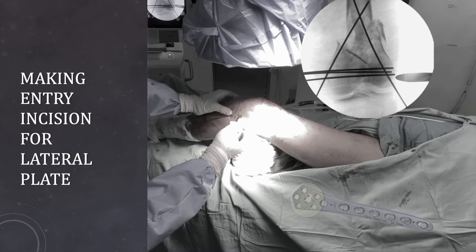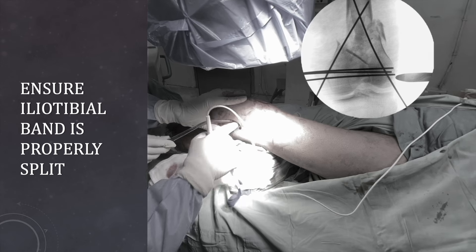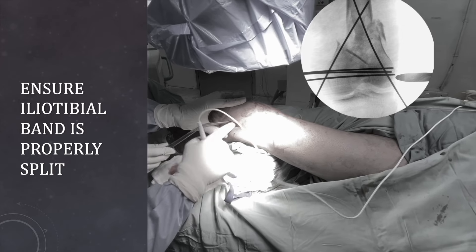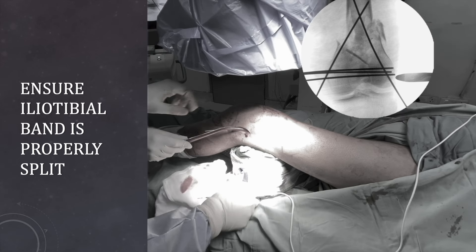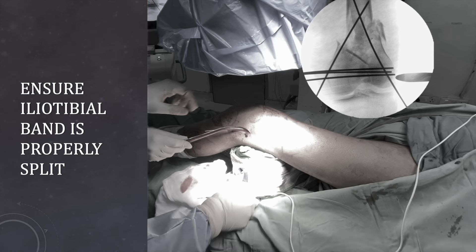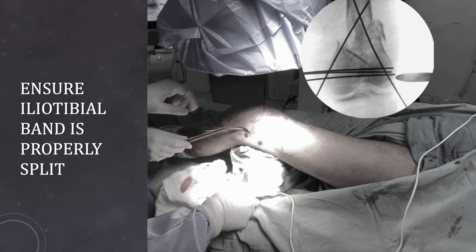We give the incision according to the size that we have determined. The first layer is the subcutaneous layer, then after dissecting the subcutaneous layer we have the iliotibial band. It should be exposed clearly and split properly, and once it has been clearly split, you can feel the synovial layer or a fatty soft tissue layer beneath the iliotibial band. The space should be adequate for placement of the plate. Your plate will be lying beneath the iliotibial band. The incision should be somewhere central over the lateral femoral condyle — if you go more posteriorly, you will have difficulty in plate placement because the collateral ligament and capsule are thick in that part. So it is better to go for an incision midway in the anteroposterior extent of the lateral condyle.